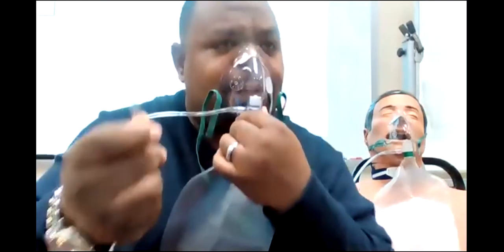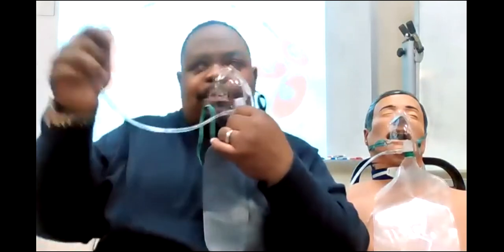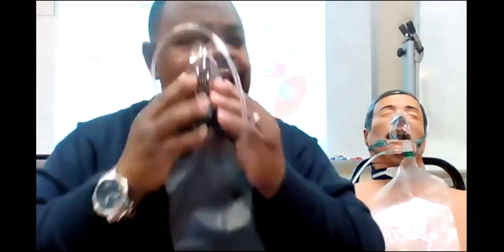So what if my tubing or my oxygen comes off the tank? You've got Mr. Johnson on 100% non-rebreather, right? And then he hits his arm and he pulls it off the wall, so it's no longer getting oxygen from the wall. And now he has this on with two blocks right here. When he inhales, nothing's in the bag, and he can't get anything from outside, he's going to suffocate. So the only reason we take one off is to prevent suffocation.